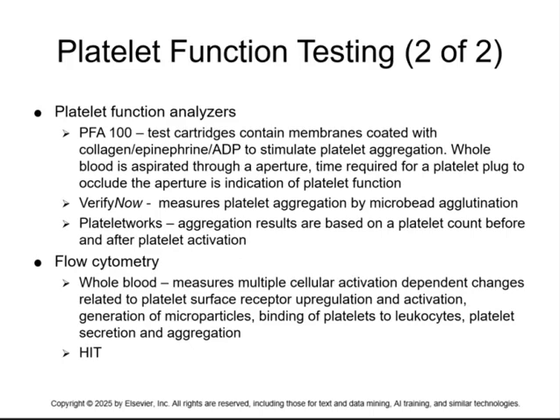VerifyNow is another one. They use little tiny beads around the platelets to look at them clumping, called agglutination. And then they have another one called Plateletworks. It's looking at the platelet count before and after they become activated. That's another one.